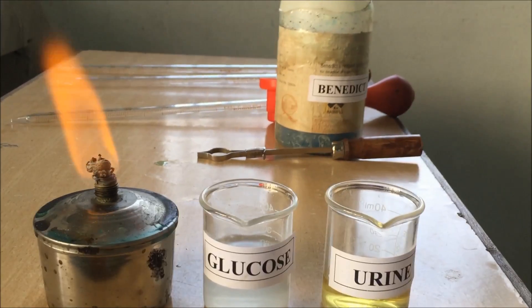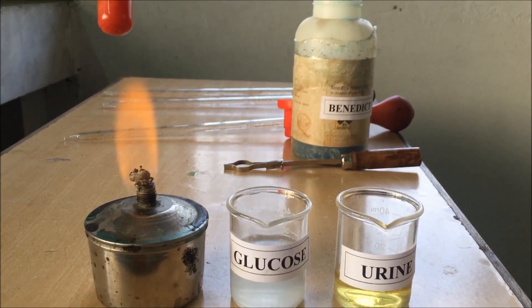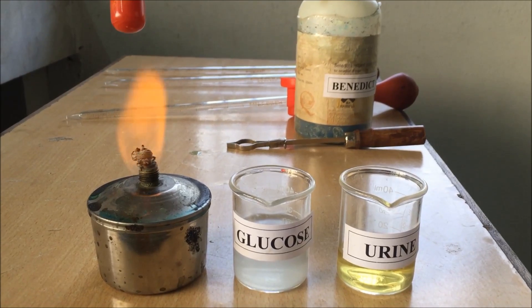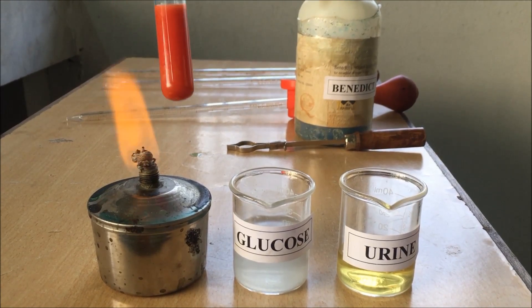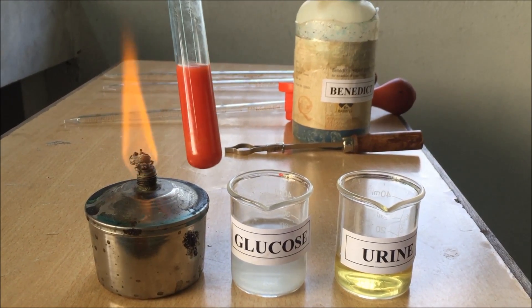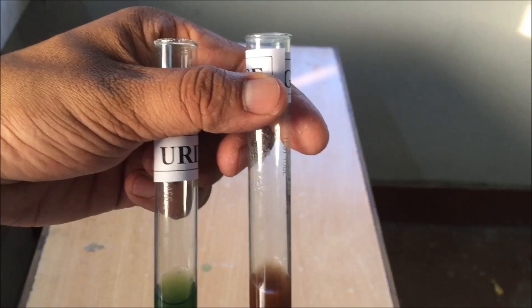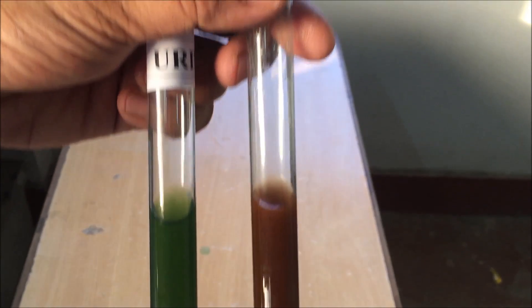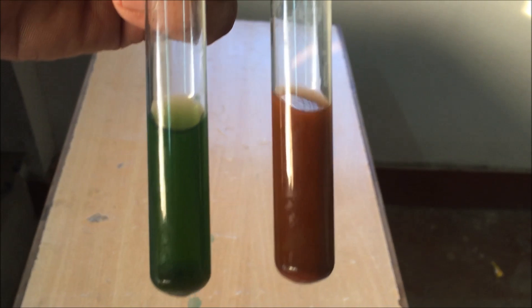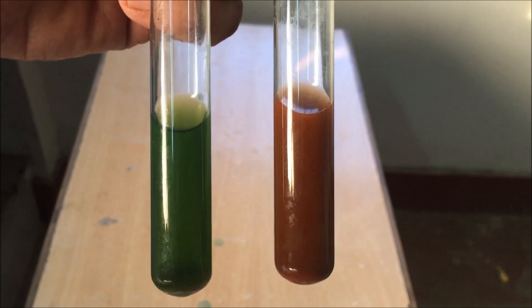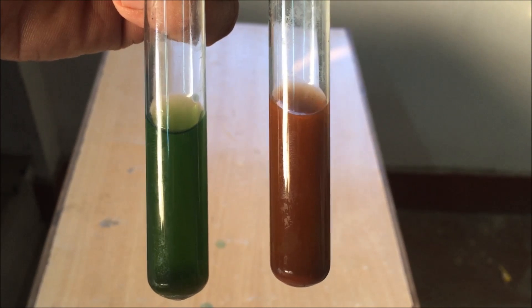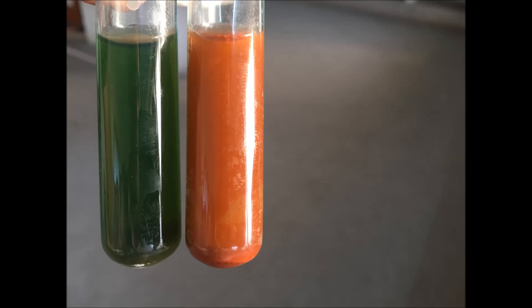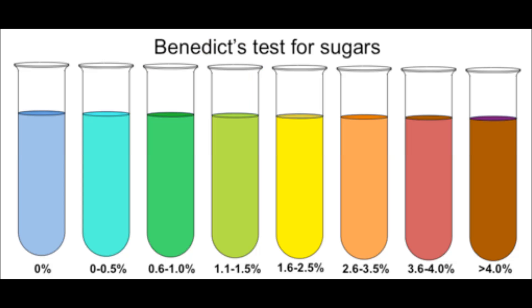If we compare both samples, we can easily observe the differences. The first sample is urine, which shows a green color, and the second sample of pure glucose shows a red color — indicating a significantly higher sugar concentration in the glucose sample compared to the urine sample.